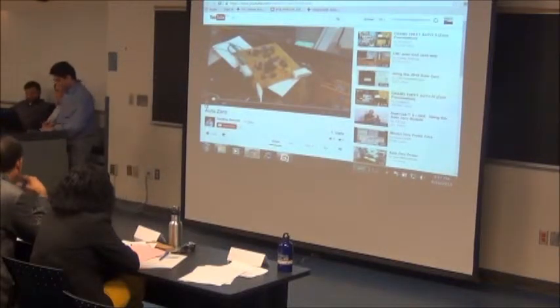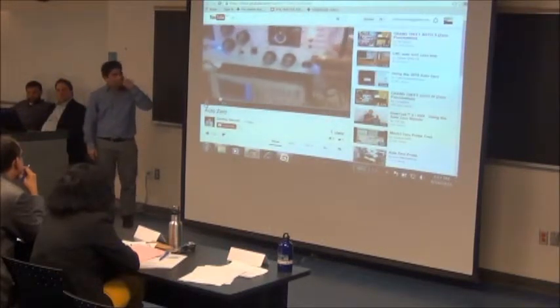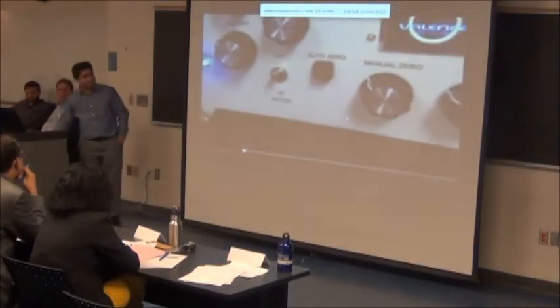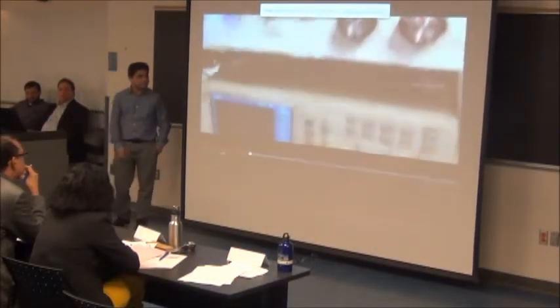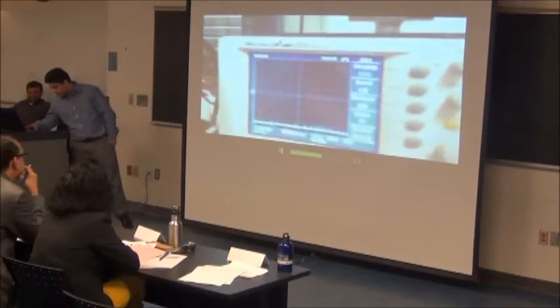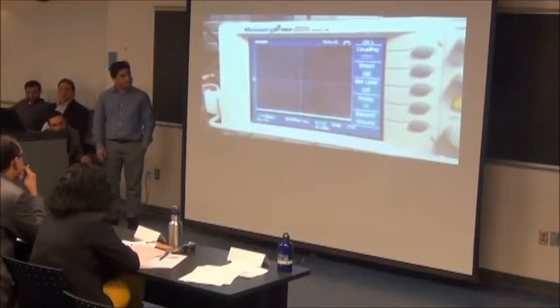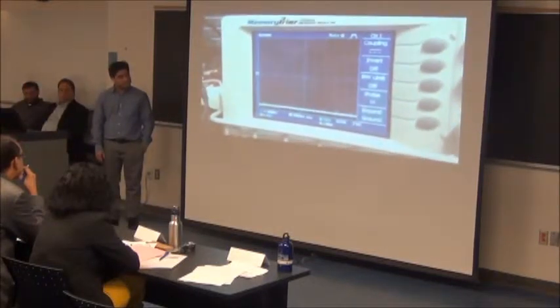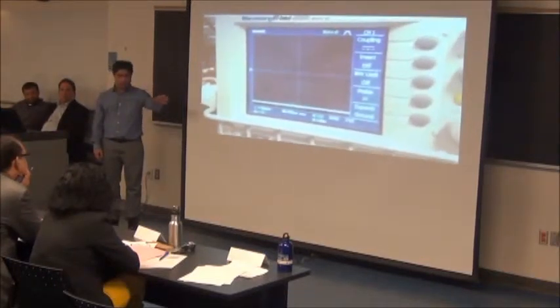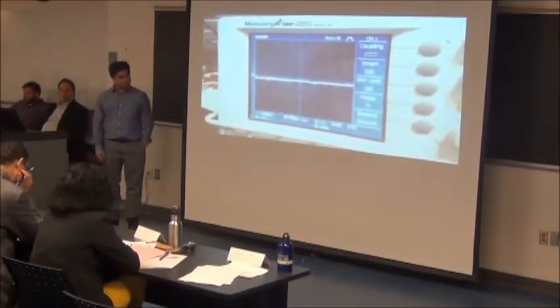So I'm going to show the circuit itself. There's the one-touch button for auto zeroing. And we're going to look at the signal right now. We're going to apply a zero signal from the simulator. So you press the zero from the front panel. And now we're going to press the auto zero, and it will zero the whole thing. Brings it up to zero.